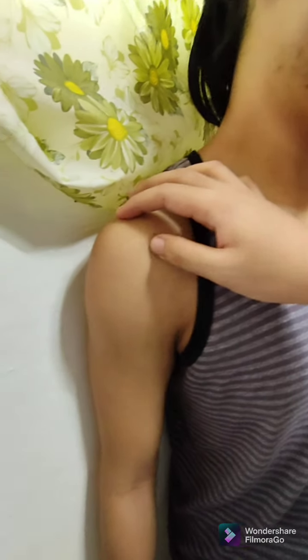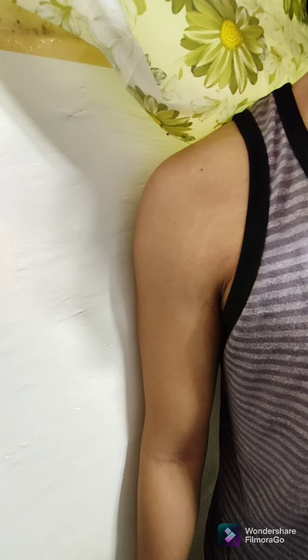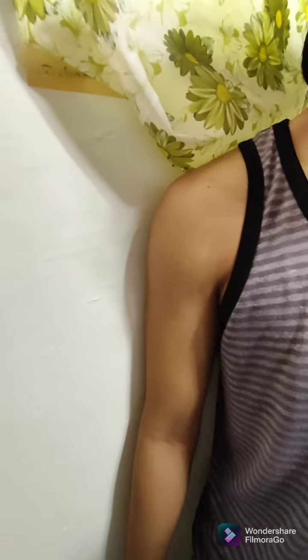So, upon assessment of my patient, makikita natin na rounded ang shoulders niya. So, in these cases, we should increase the rotation of the body. Hindi lang siya 35 degrees, kundi as much as 45 degrees. So, ayan, naka-rotate na siya. 45 degrees exactly against the IR.